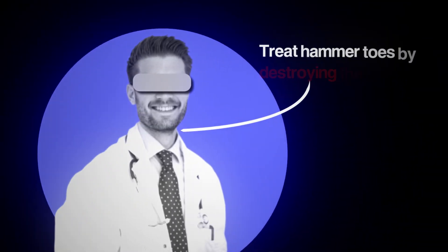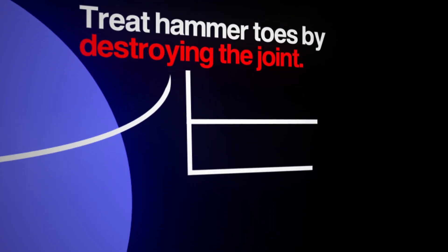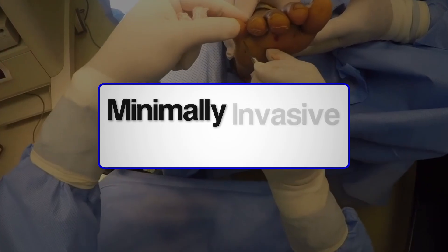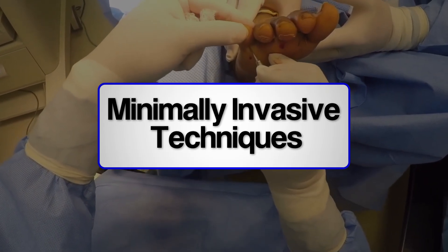Most doctors still treat hammertoe by destroying the joint, such as arthroplasty or arthrodesis. I used to do the same, but once I discovered minimally invasive technique, everything changed.